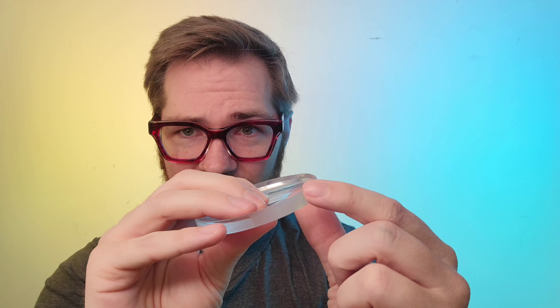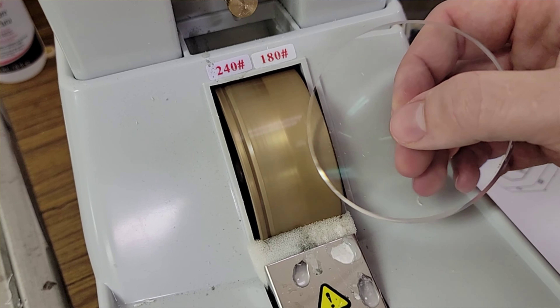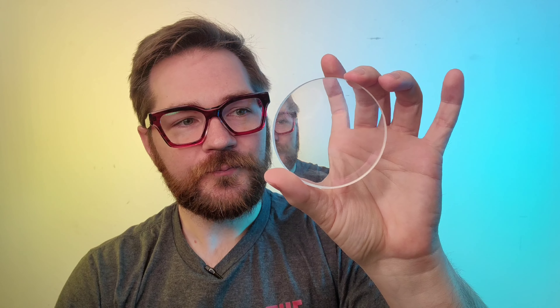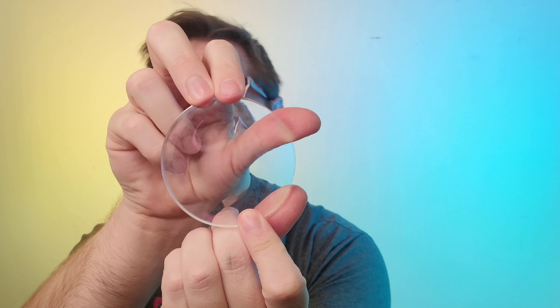What it amounts to is that the safety bevel is going to determine how much of a white edge you have. I've taken this lens and gone very heavy on the safety bevel here — you'll see it's almost rounded off, more like a rolling polished edge on a high minus. And then right here is just a light kiss — barely took that sharp edge off. If you don't really know what you're looking for, you won't even see it's missing, and you'll notice we don't really have that strong white edge around it.